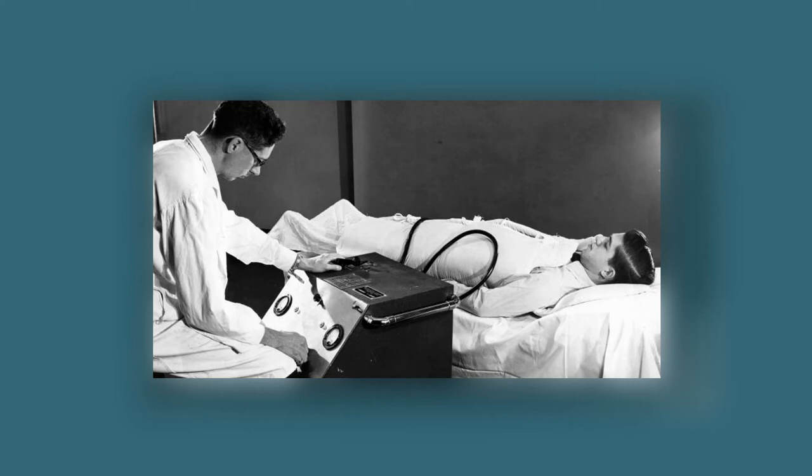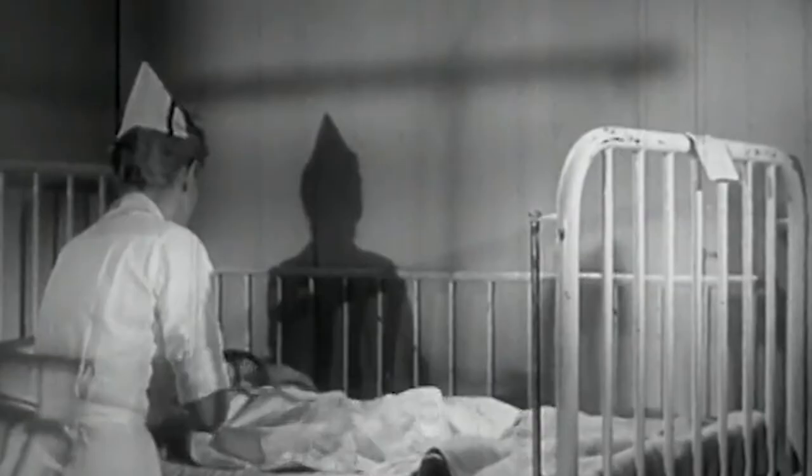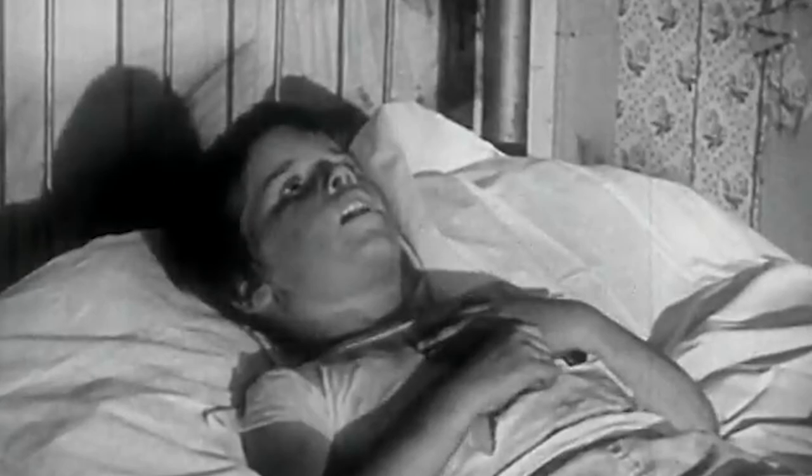That's because in 1957, pacemakers were bulky boxes that were wheeled around on carts and plugged into electrical outlets. When the power went out, doctors were left scrambling to try and find ways to keep their patients' hearts pumping in the dark without the pacemakers for hours.